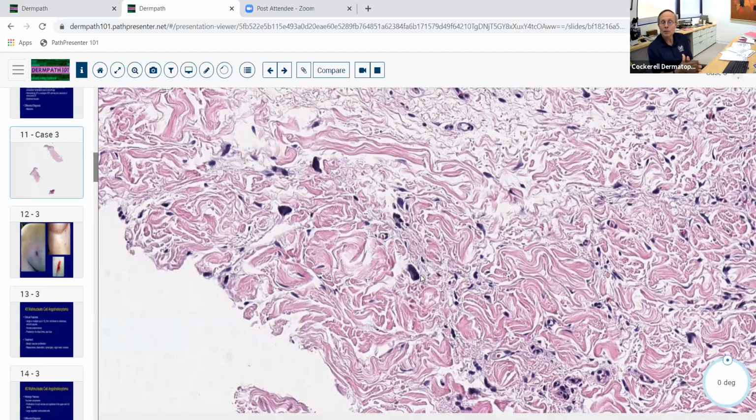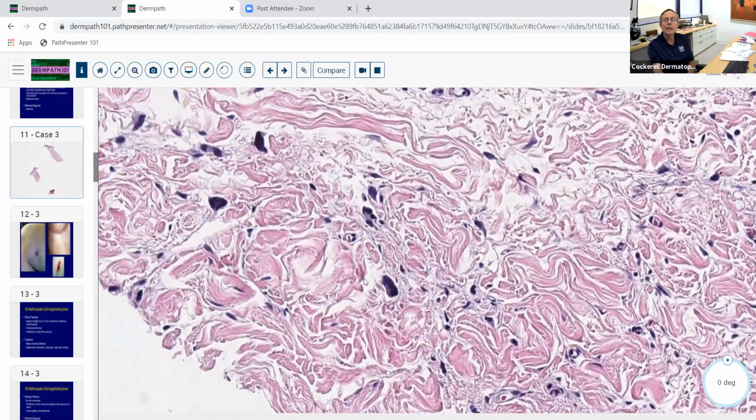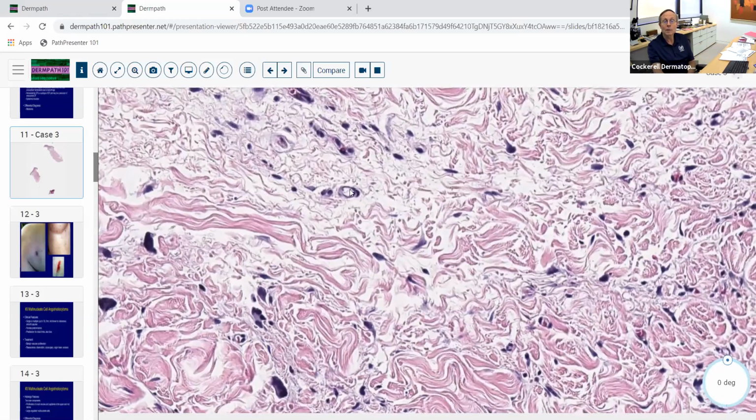Okay, so they punched into a neoplasm, which is okay if they didn't know what it was. Maybe it looked kind of reddish and they thought it was inflammatory and it turned out to not be inflammatory, turned out to be a neoplasm. But let's take a look and see what we've got here. We've got these cells that have multiple nuclei in there. This almost looks like a little histiocyte in a way. We've got other cells that are more dark staining, pleomorphic. We've got some blood vessels here.